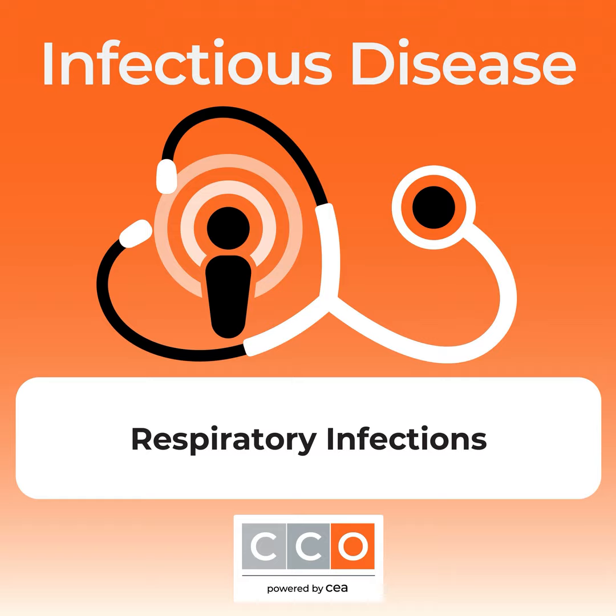And those most likely to benefit from upper respiratory tract infection panels are those who are immunocompromised or who have severe illness. And just remember, although these panels are great, especially for lower respiratory tract infections, it's still really important to do things like culture, susceptibility testing, gram stains, and BAL cell count fluids. And with that, I hope you enjoyed this and learned a lot. I think these respiratory tract syndromic panels are really beneficial for patients, and we need to continue to push the envelope to understand how to best use them.